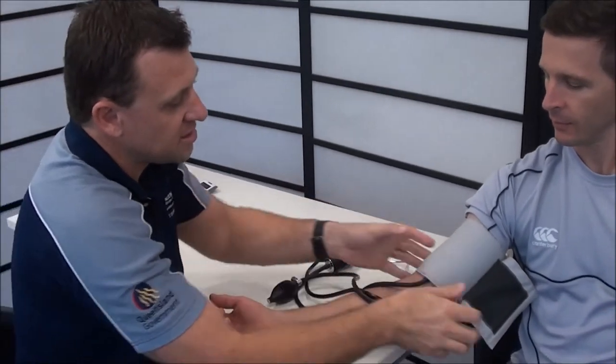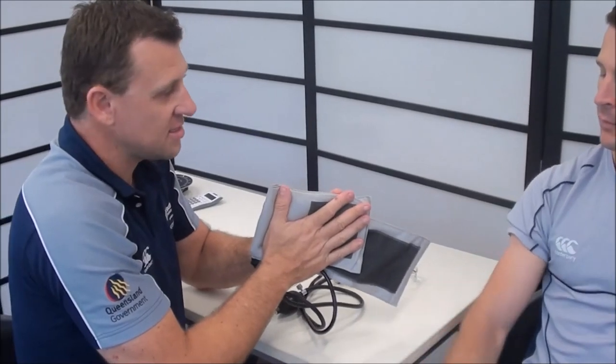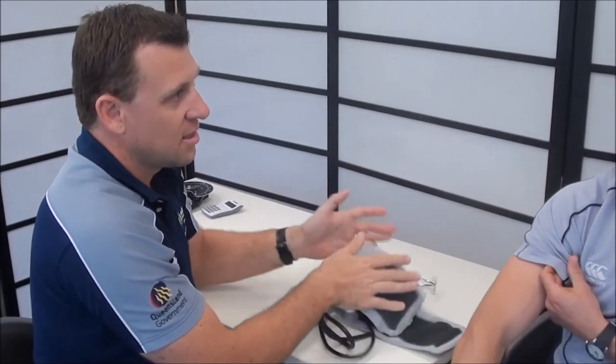Once you've measured the blood pressure, make sure you take the cuff off and squeeze all the air out — that's now ready to use for the next client. I would then record my result and tell the client. Weston, that was 110 over 70, which is absolutely fine.